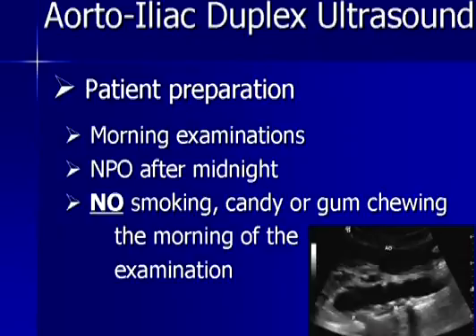Preparing the patient is not terribly complex, but it is an important part of the study. These studies should be scheduled in the morning simply because you want the patient to be NPO and not eat or drink anything after midnight the night before the study.